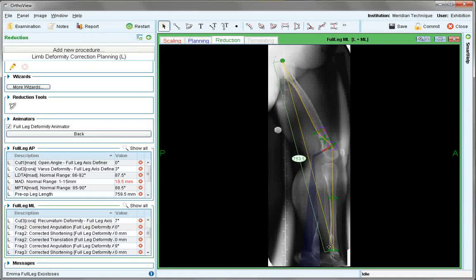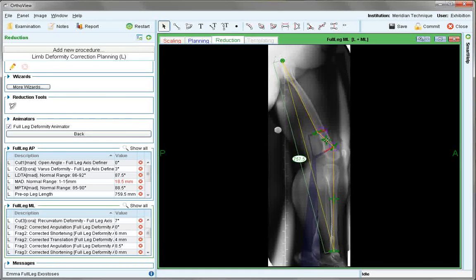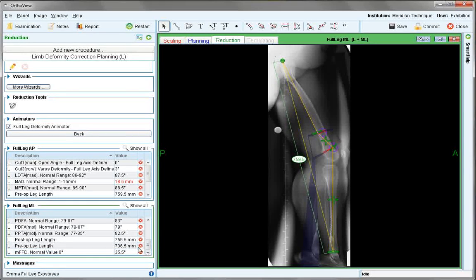Then use the handle to make any angular correction. The amount of angulation can be checked at fragment 3. Use the translation handle to produce any lengthening as appropriate to this non-angular manual cut. Overall lengthening is shown. This can also be done on the AP view.